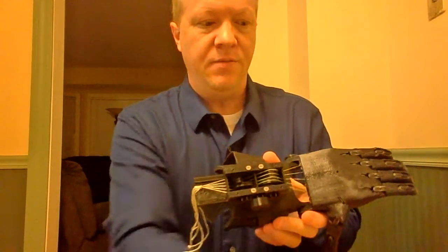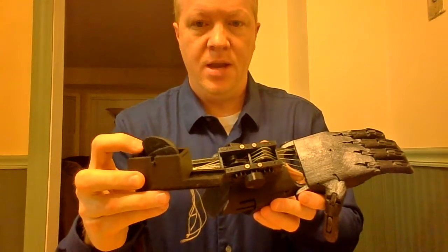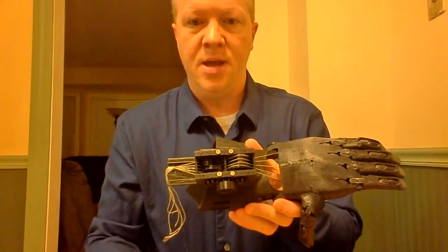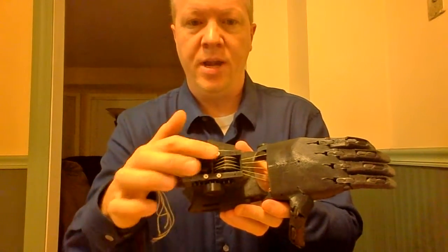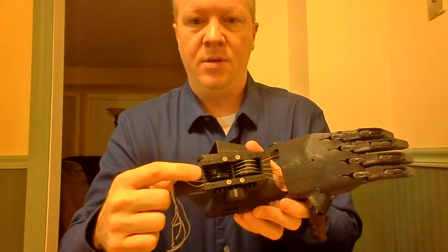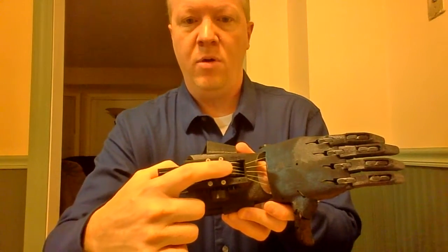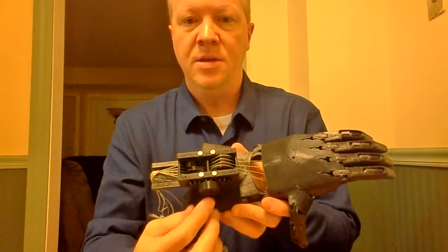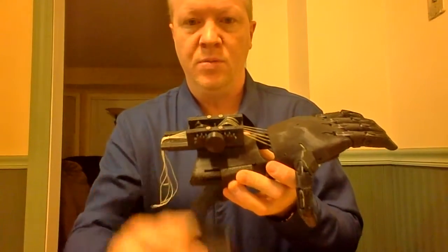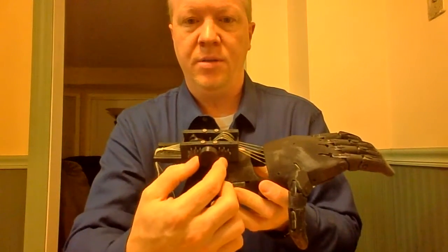What I've done is I've taken the cam profile here and made it exactly half the size, and I put two of them side by side. One is 180 degrees out of phase from the other, and then the string goes through underneath one cam, through another wall, and up over the other cam, and then through it into the hand. So I effectively get the same output as this one, but it's only half as tall. And I've got two gears and a little rotating knob here.